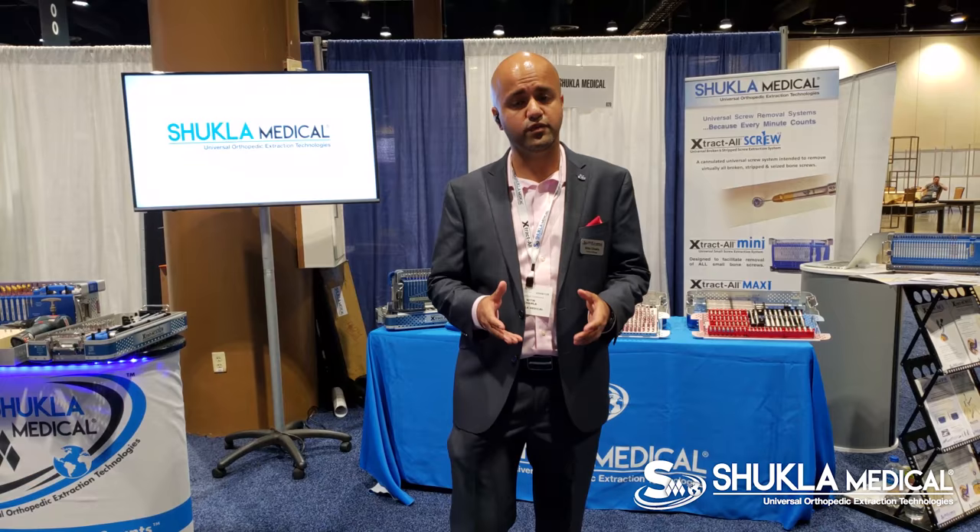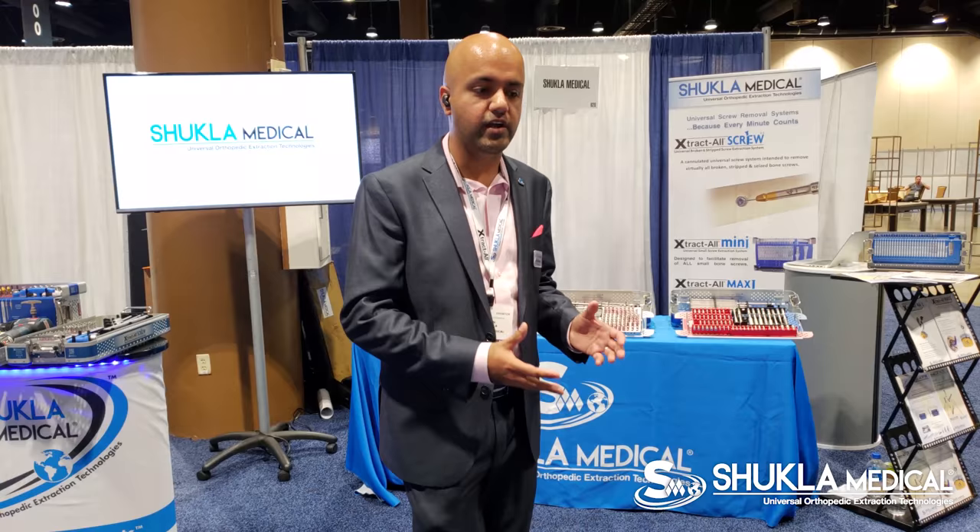Today we're about to launch the brand new upgrade to our WinQuist system, which is the IML removal set, and it's fourth generation. Shukla Medical started as it acquired Snap-on Medical in 1999.